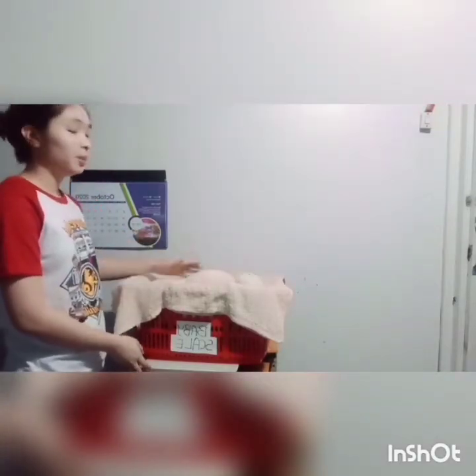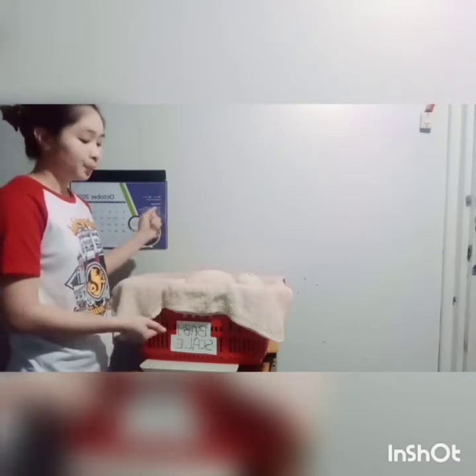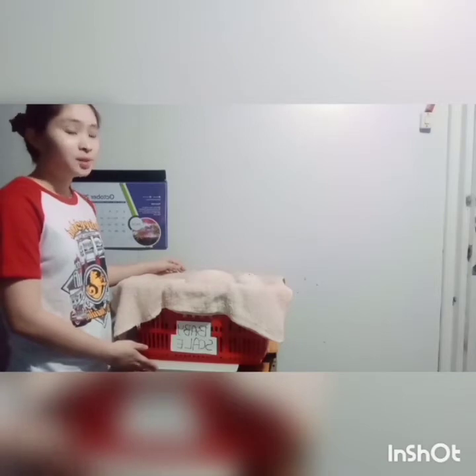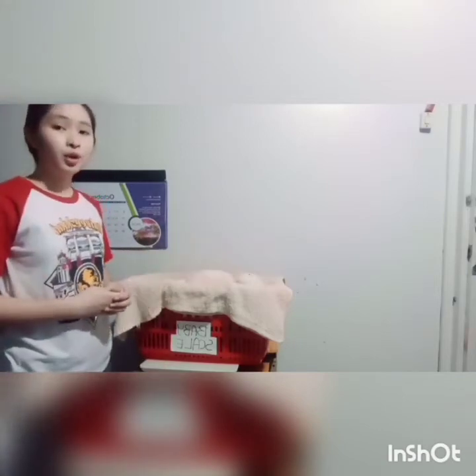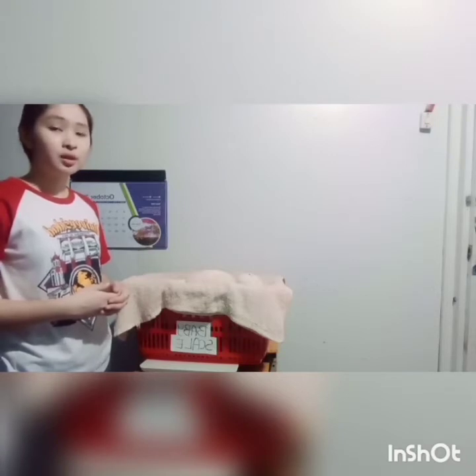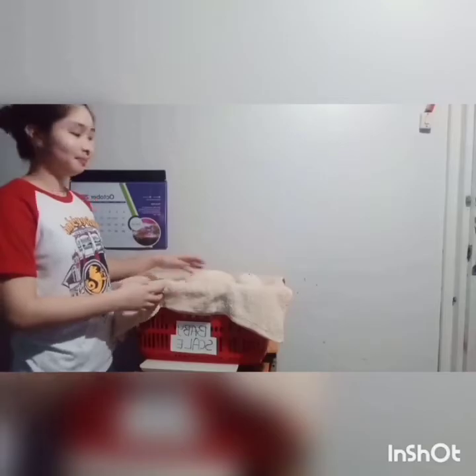We need to make sure that the baby is relaxed and not moving agitatedly so that we can obtain an accurate measurement. Once the baby scale reads the measurement, for a newborn baby at 42 weeks gestation, usually the normal range of their weight for a baby boy is 2.63 kilograms to 4.22 kilograms. For a girl, the normal measurement varies from 2.55 to 4.08 kilograms.